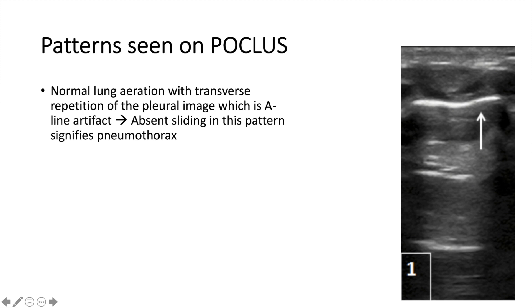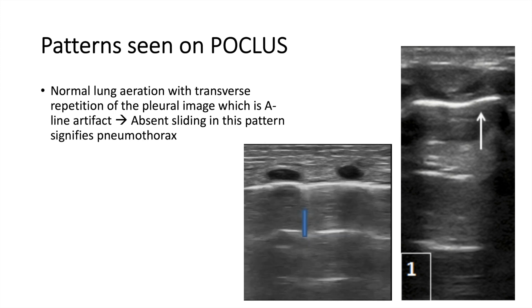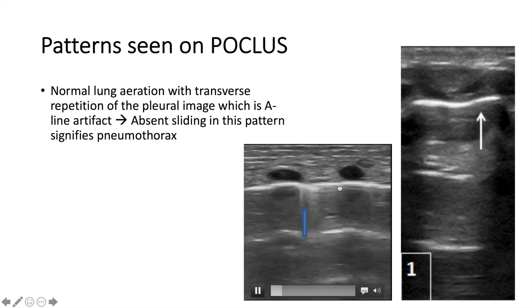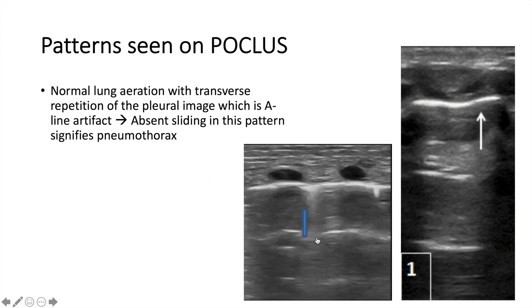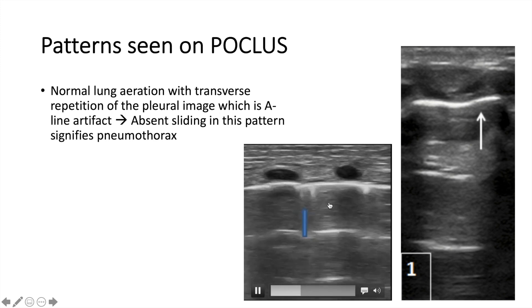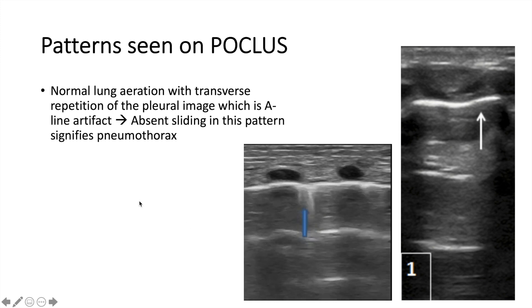The first pattern is the well-aerated or normal lung. You can see the white line here below the ribs — this is basically the air-fluid interface in the pleural space. You see the sliding sign here; it's the two layers of pleura sliding on each other, and this is very reassuring. You can also see the A lines here. Pay attention that A lines have the same distance between each other — that spacing is equal and consistent. This is normal.